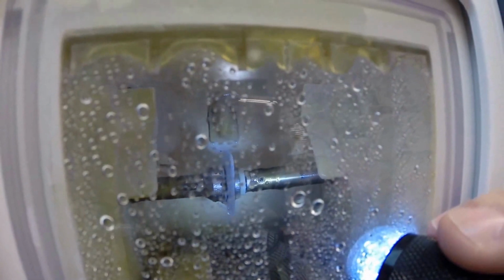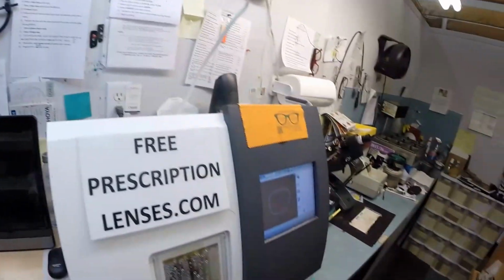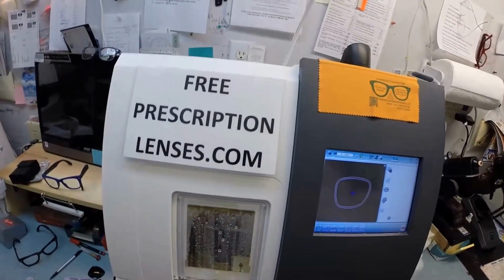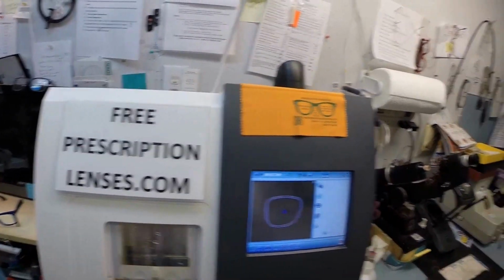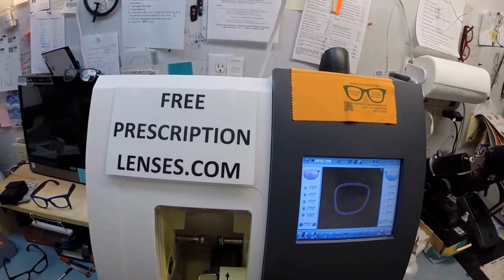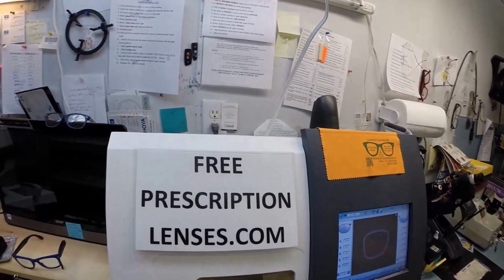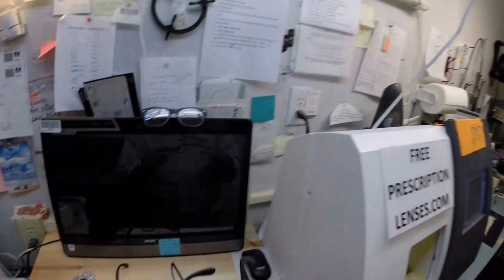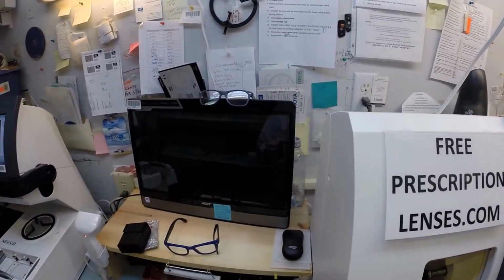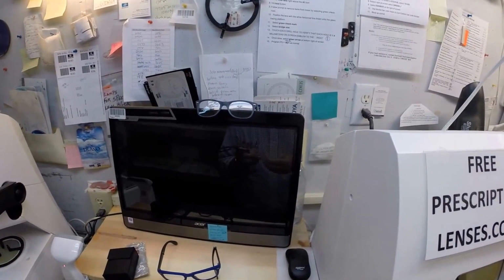So that little spinning wheel you see there, that's what's applying the safety bevel to the rear surface of the lens. Now again, you're not going to have any edge thickness, but for people who do have stronger prescriptions, should any of that lens protrude from the back surface of the frame and come in contact with the cheek, that will be nice and smooth and you would not have any rough edges, as smooth as the frame is. So again, I'm going to tuck it in at the outside corner once I get all that optical sawdust off of there.